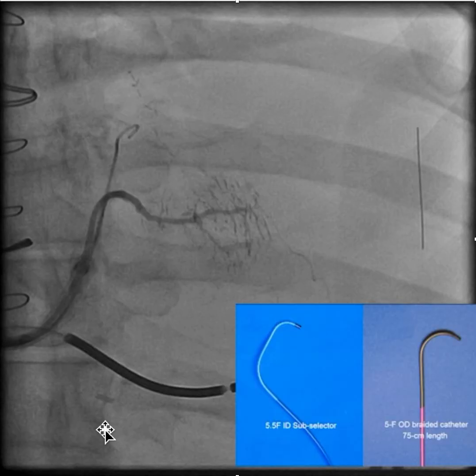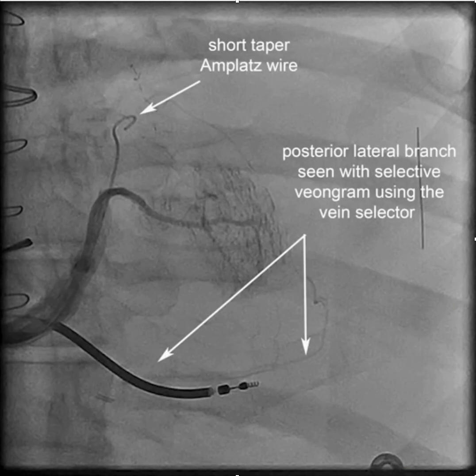Out of respect for the patient's creatinine, rather than doing a balloon venogram, we knew there was a branch here, so we did a selective venogram, which revealed a large posterolateral branch in addition to a small branch.